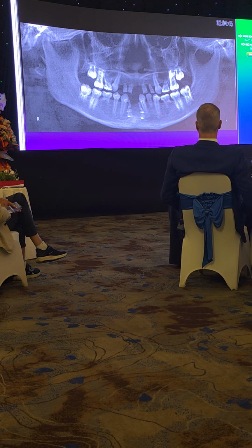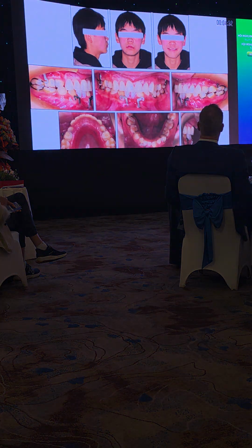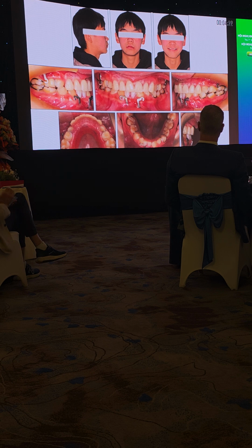So those are the plates that you put down in the edentulous area. Alright? So you're going to protract. We reduce it from minus 13 to about minus 6.5. And then you basically put prosthetic teeth until the patient has finished growth, because the patient is only about 14, 15 years old.